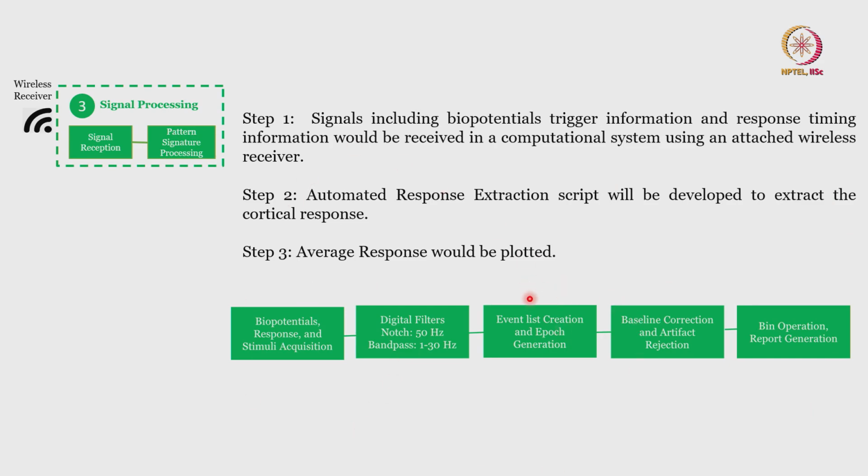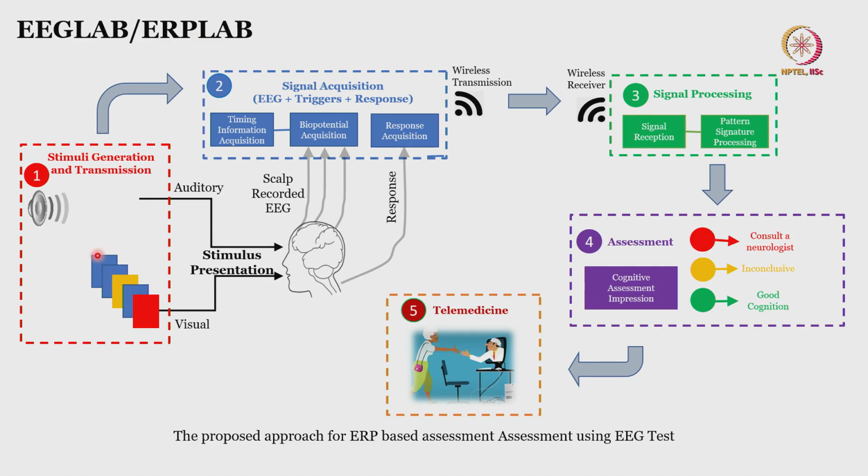Prior to moving to the code walkthrough, I will quickly tell you what the experiment is. The experiment is on visual evoked potentials to assess working memory and more. You can see here that three types of images are shown to a subject. One of them is more frequent, the blue one, and the other two are rare, or less probable, images. The stimulus design is another aspect we could go into in detail.